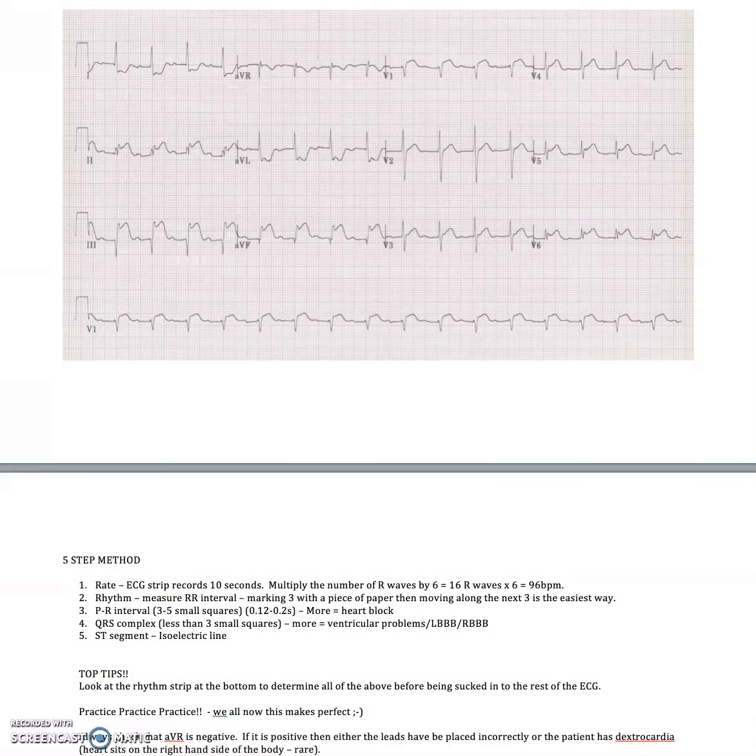They are made out to be very complicated by the textbooks and the literature out there. They're really not that complicated if you break them down slowly and in little pieces and follow a structured method to interpreting them. So I'm going to try and make that as easy as possible for you.